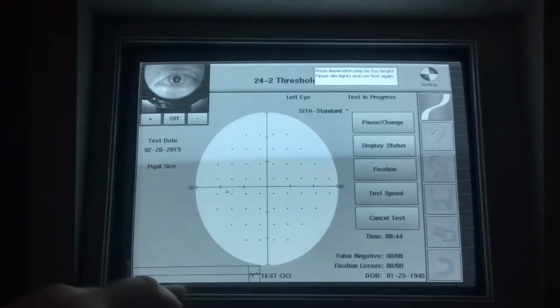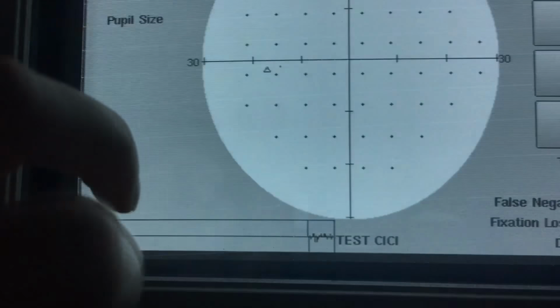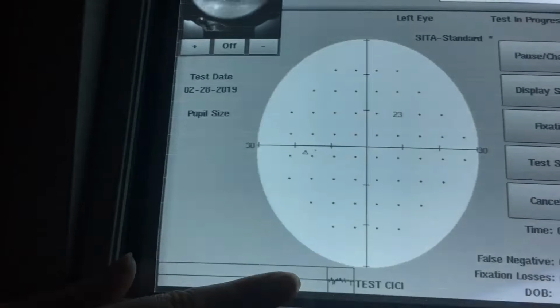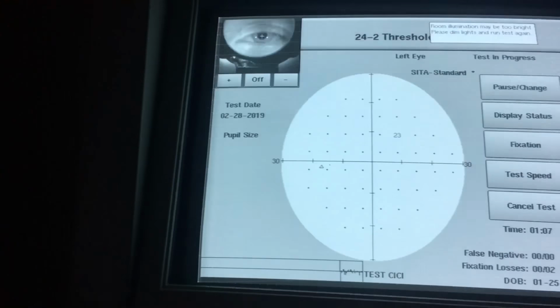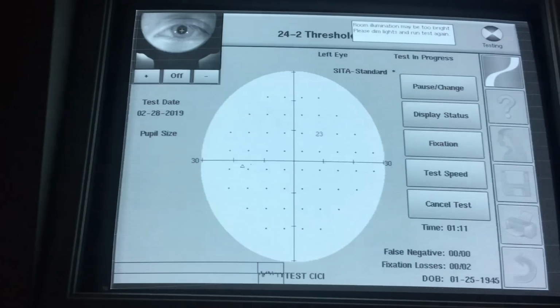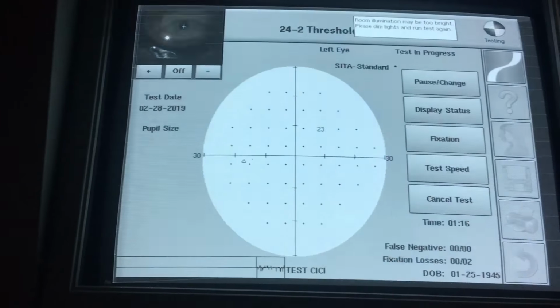Right here on this gaze tracker, every time her eye moves, it's a tick up. Every time she blinks, it's a tick down. So we're pretty close to the center line, which means that our gaze tracking is doing well. If she makes a lot of mistakes in a row, the machine will beep at her. It'll go beep beep, and that might be a good time to pause the test, re-explain the test, and ask them if they have any questions about how the test is done.